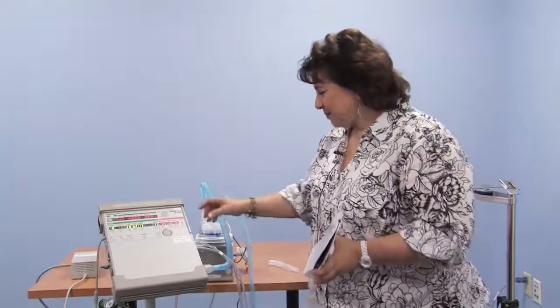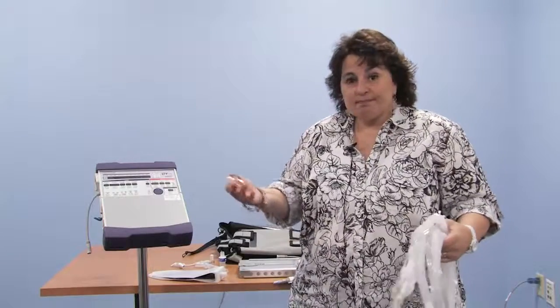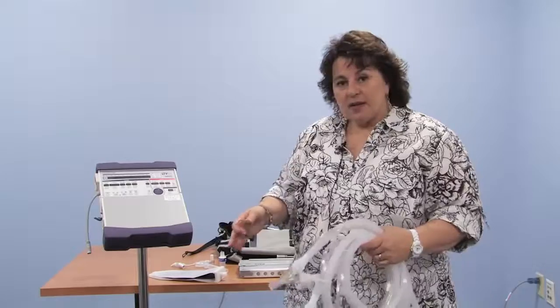So let's move over now to the 1150. We're looking at the LTV 1150 now. With regard to daytime, leaving the home for doctor appointments, leaving the home for the playground and whatnot, the LTV does supply what we call dry circuit. So this is a circuit that does not have the heated wires. It's not going to be used with a humidifier because you're going out. It has the same adapter that goes into the gas outlet.